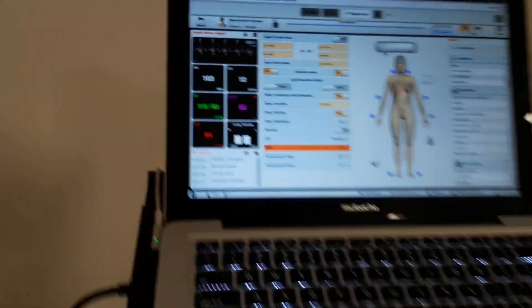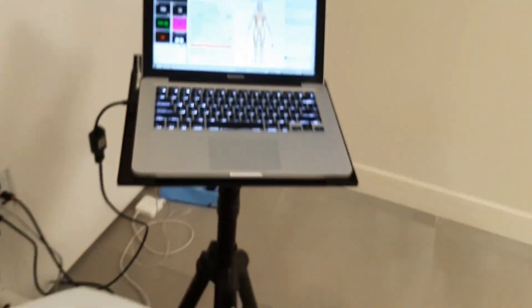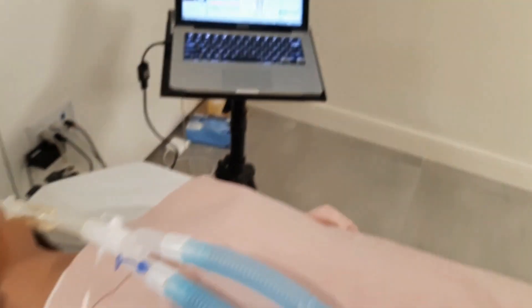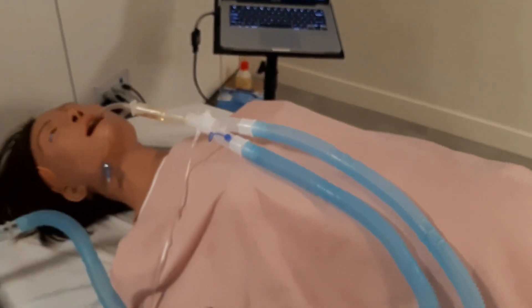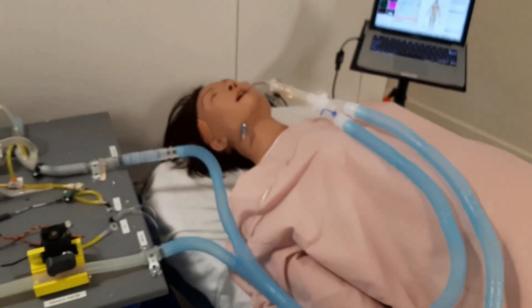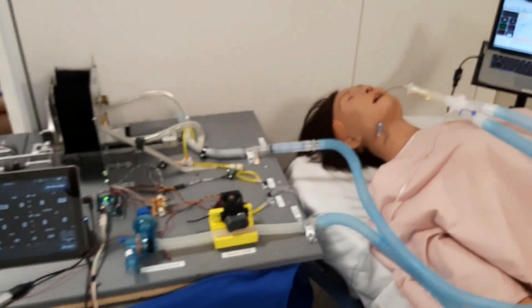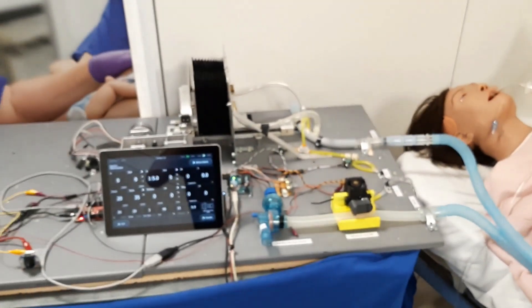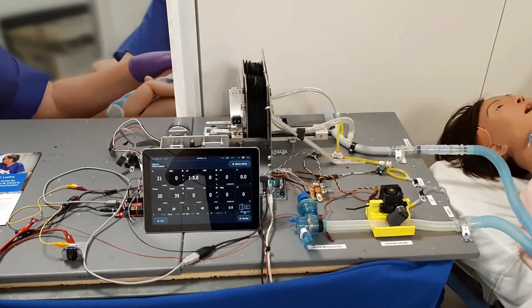Panning back to the patient, we once again notice the rising chest and the ventilator prototype set up in action.